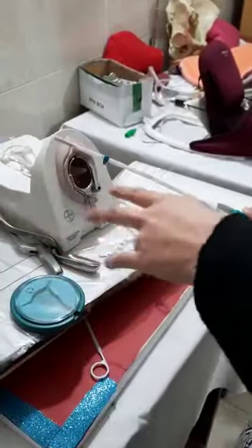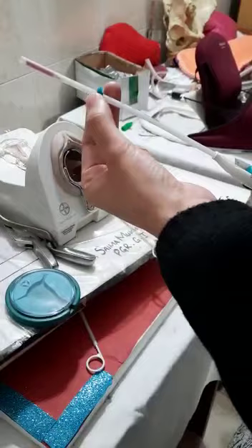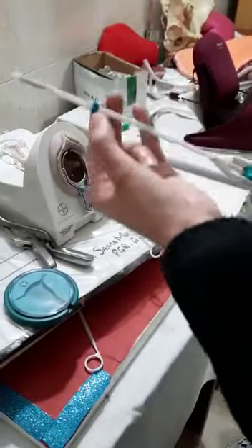I will introduce the uterine sound to measure the exact size of the uterus and will set the flange to the corresponding uterine size.